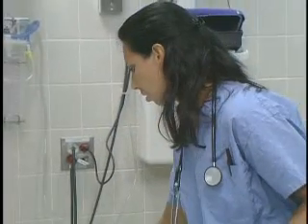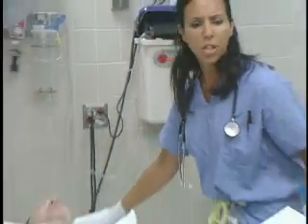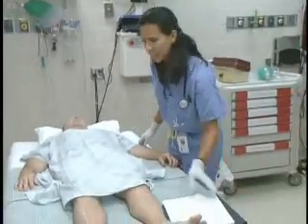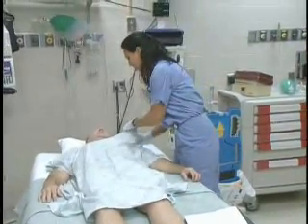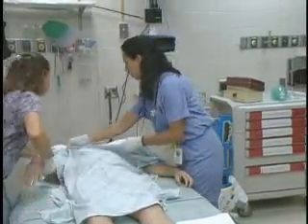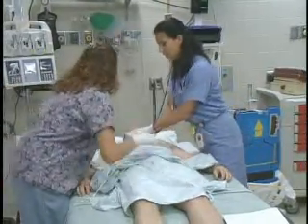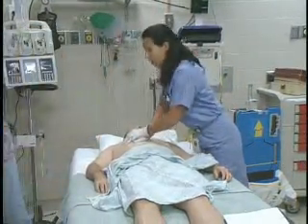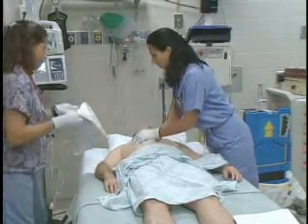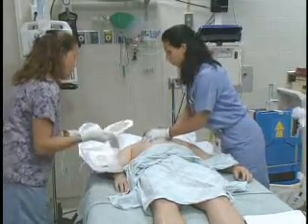Mr. Spinetti, he has no pulse. Jen, call a code — I need help in room three. Let me give you a hand, I'm going to start CPR. Can you get the defibrillation pads on? I don't know what happened, Jen. I was getting him to sign out to go home and I came in and he was blue.